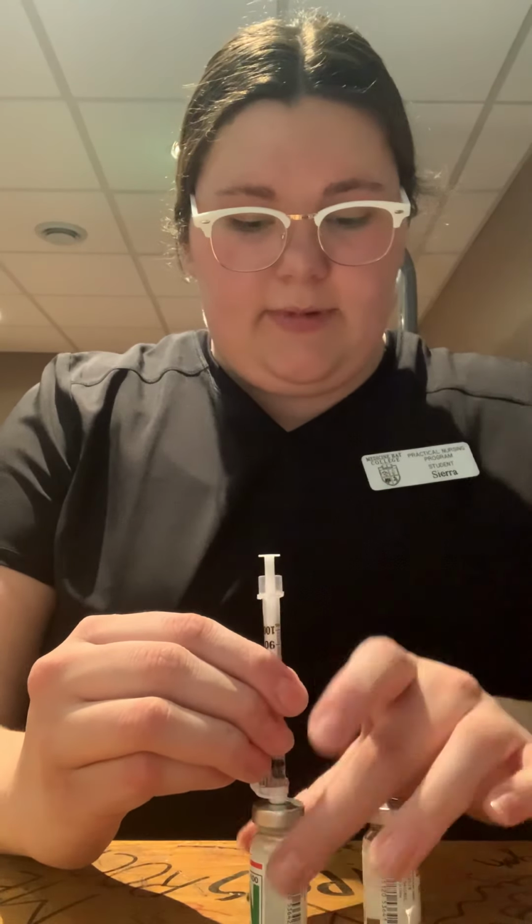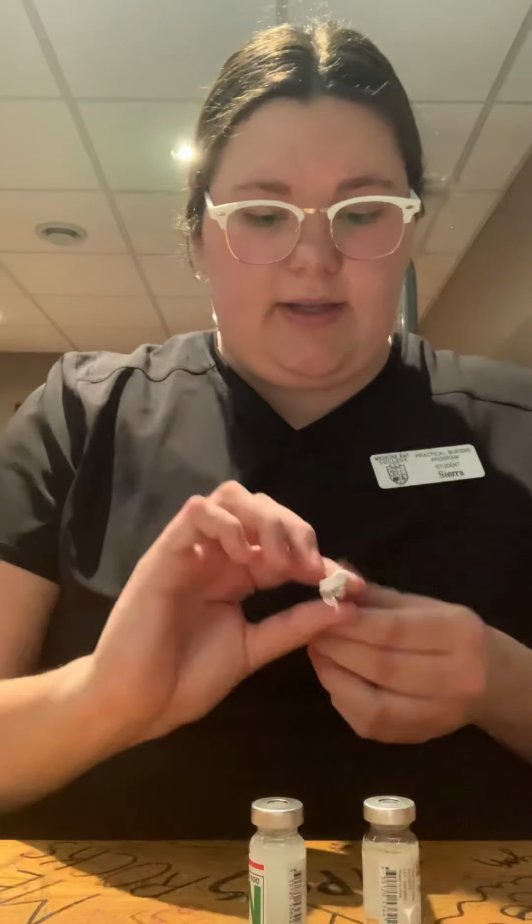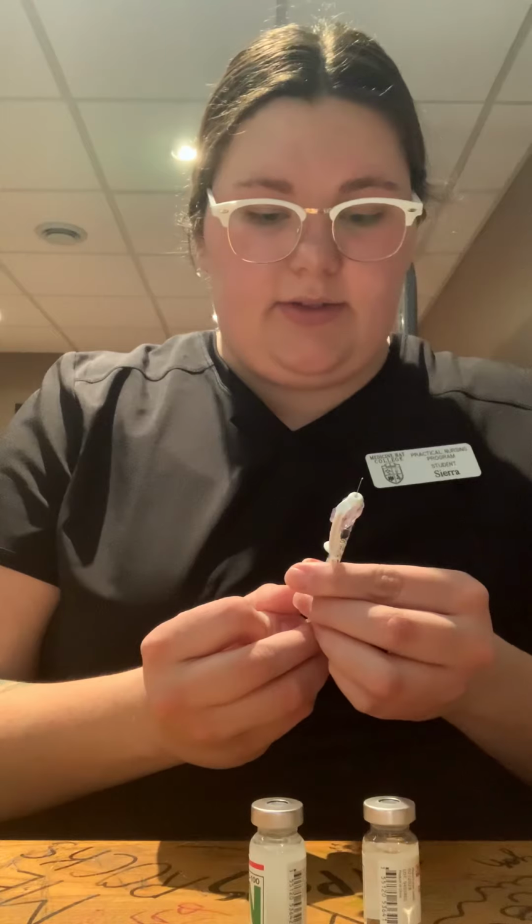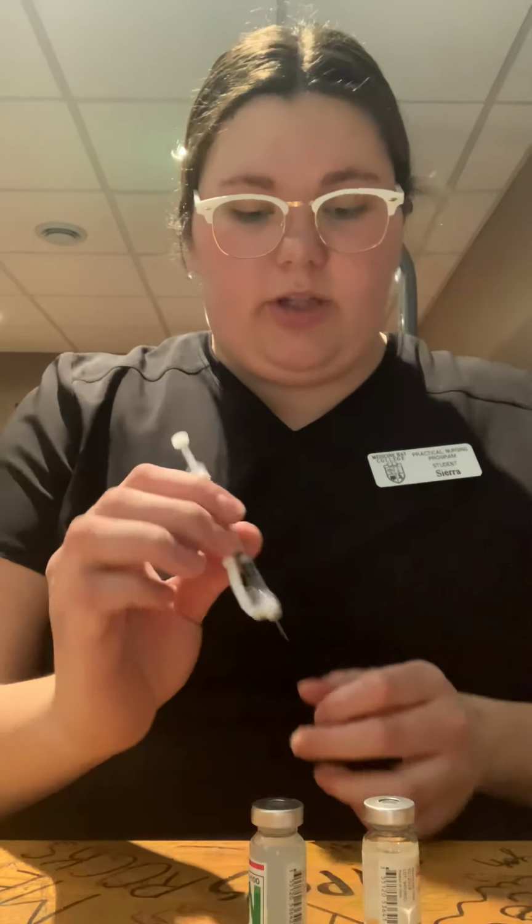Put that in straight out, and then we will be putting 20 units of air into the Humulin R.